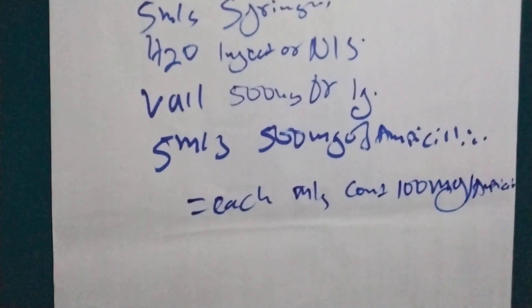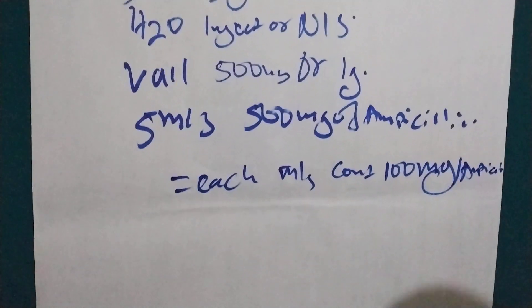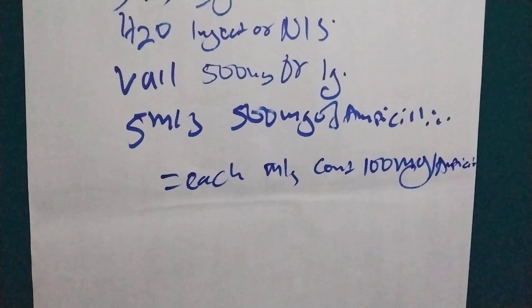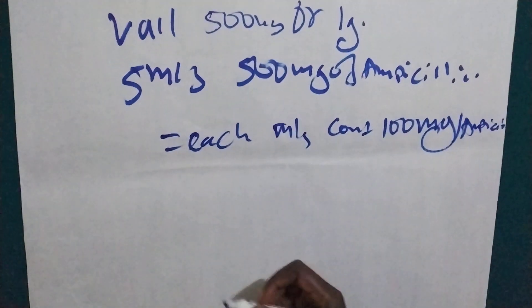So after putting, you have to shake it well so that the powder will dissolve. Then the doctor has prescribed this.